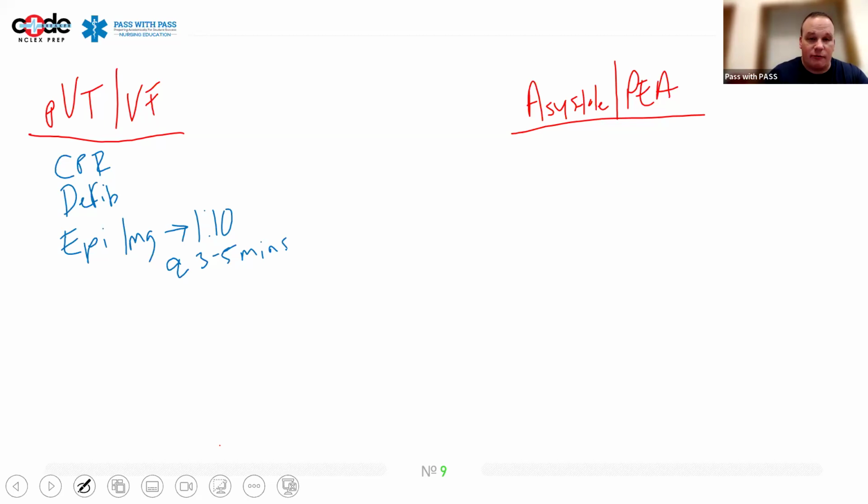So remember, every 2 minutes, we are stopping compressions to analyze the rhythm and check to see if the patient has a pulse. So I'm going to continue down this list as if we are checking every 2 minutes, but the patient never changes, okay? So we are going to defibrillate again after our 2 minutes is up. And what I should have spoken about up here is what we are going to defibrillate at.